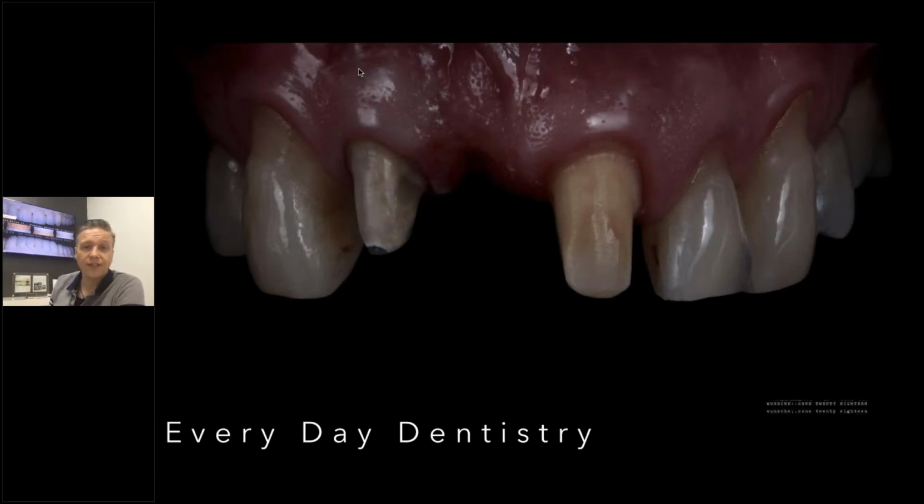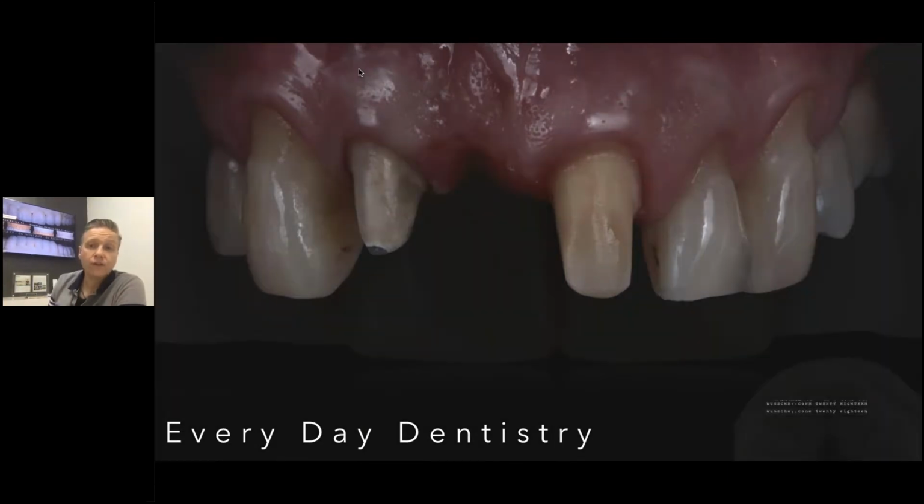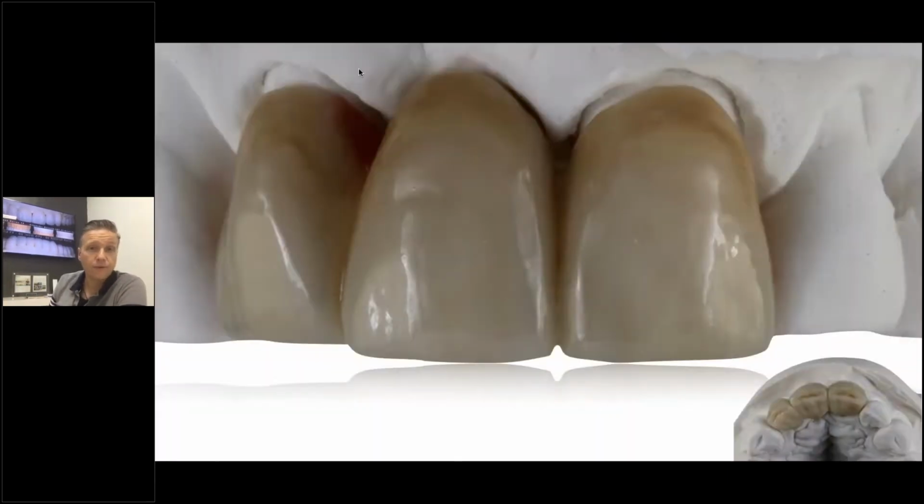So to manage that, we have to utilize a material where we can mask the underneath colors. That's very important. With that, we could not use a Zolid FX, for example. We could not use a cubic zirconia. Why? Because that zirconia is too translucent and would transmit the underneath color to the outside. We definitely want to avoid that. So here we chose HT plus for layering.